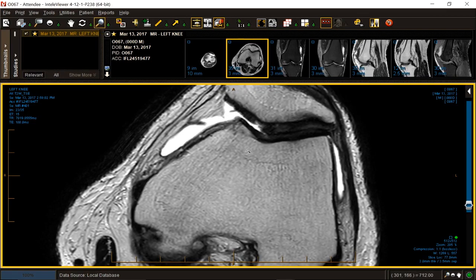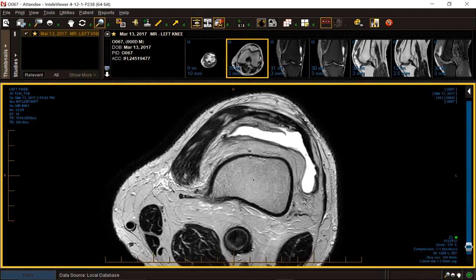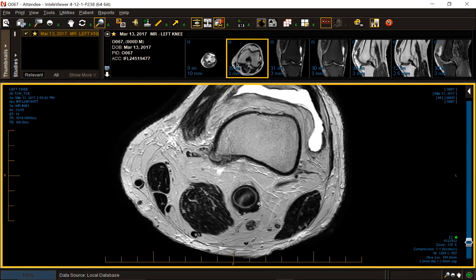Thank goodness it's just that and not a life-threatening problem, like a popliteal artery aneurysm that you might miss because you're focused on her anteromedial pain. So she dies from her aneurysm, but you fix her anterior knee pain.